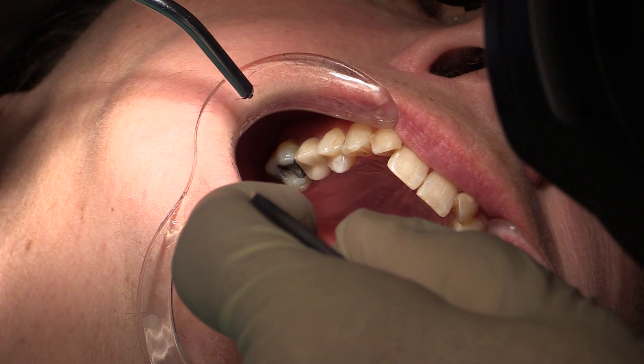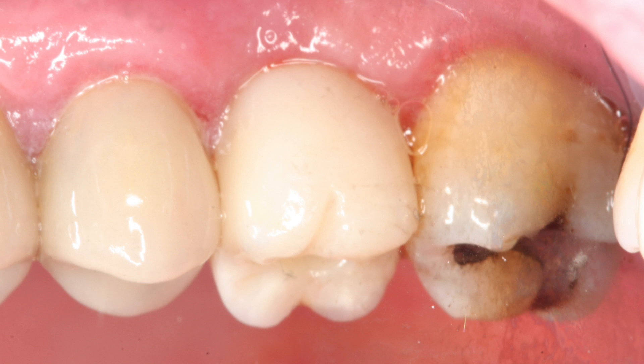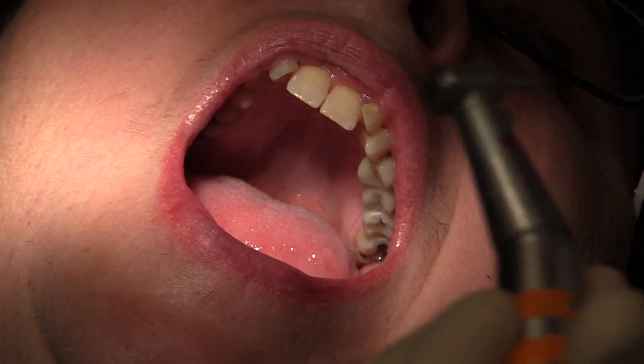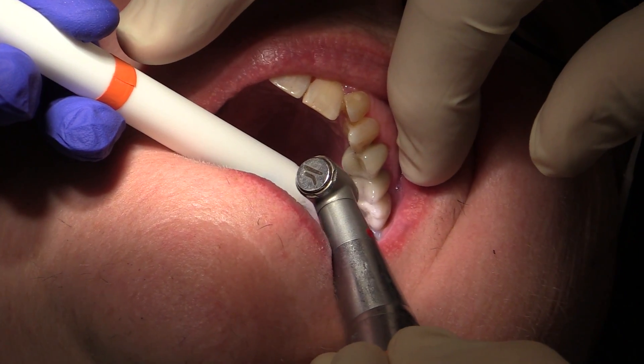After a few light cures this is ready — we'll take a couple pictures and look at it. It looks beautiful. This is a great option: full contour zirconia at 1400 megapascals, very appropriate for the forces in this area of the mouth — up to 250 pounds of pressure, and up to 1000 pounds in clenchers. Instead of a gold crown, this doesn't carry the cost of gold. In my mind it's replacing many gold restorations on implants because of cost and the 1400 megapascal strength. Many patients also want a white option — this comes in eight different shades, and you can stain, glaze, or add porcelain using a cutback technique.